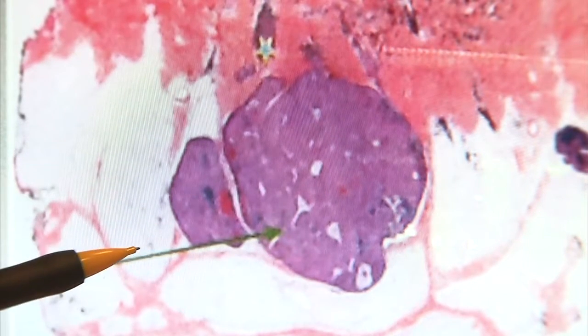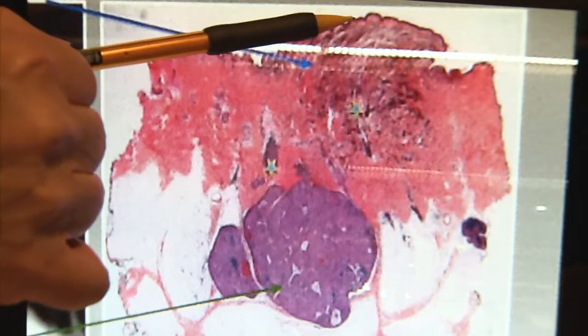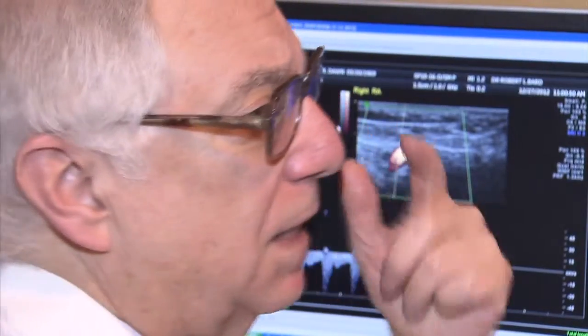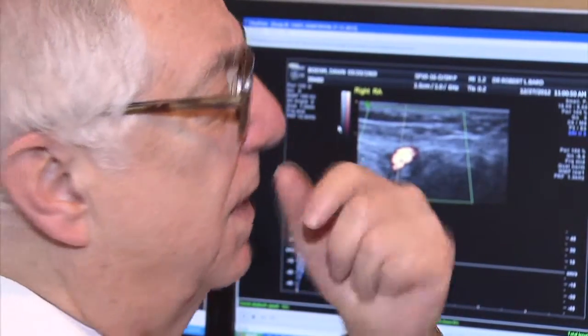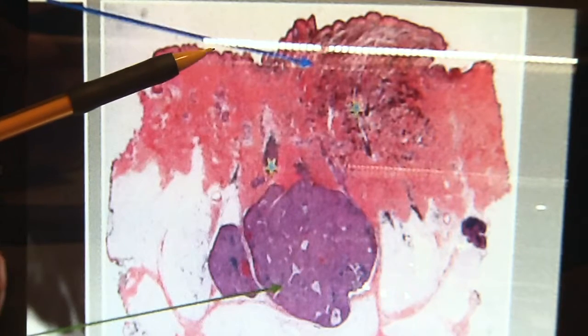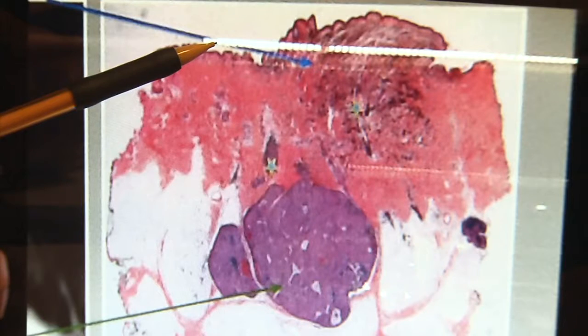You're looking at a melanoma just poking a bit above the surface of the skin. Standard practice is to shave a little bit off the top and do a biopsy. But that little top turns out to be just the tip of the iceberg. Dr. Bard's use of a 3D ultrasound on the melanoma shows us how. So the white line is where the shave biopsy would be on this malignant melanoma.